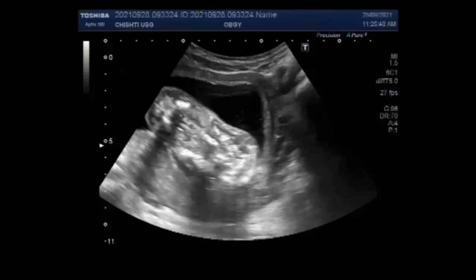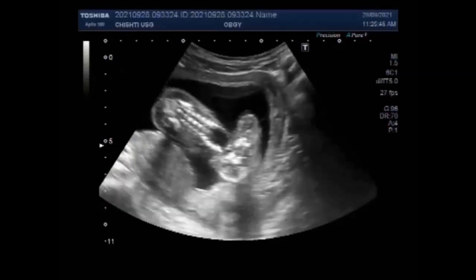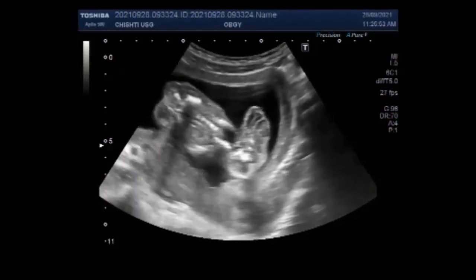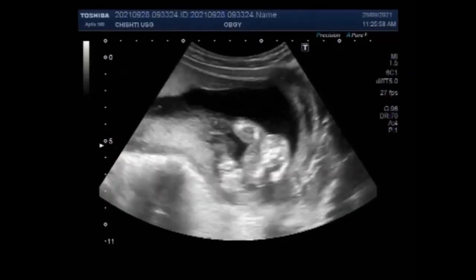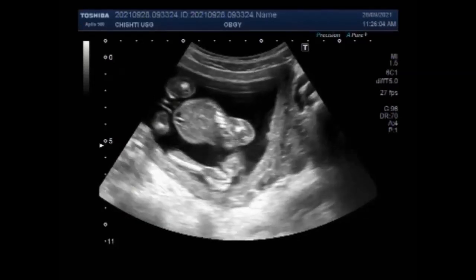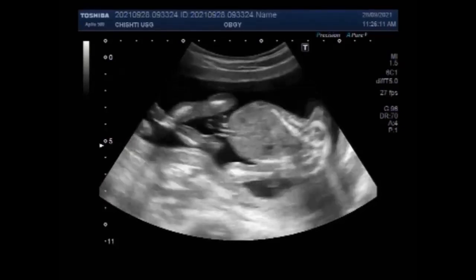Both can be seen on ultrasound in the first trimester, but here the duration of the pregnancy is about 17.5 weeks. You can see the fetal heart, fetal cardiac activity, and the fetal movements.